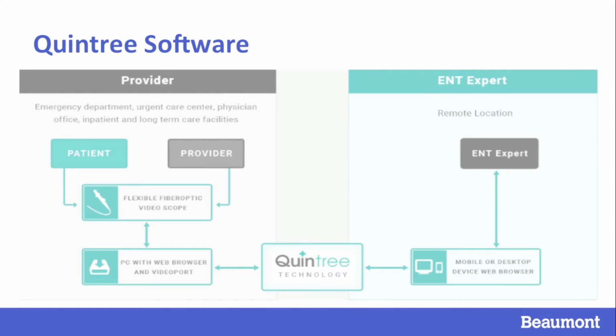Procedures are performed with the provider at the patient's bedside and the expert logged on remotely through the Quintry interface, watching the procedure in real time. Experts have the ability to communicate back and forth with both the provider and patient, as well as save photos and document notes within each encounter.